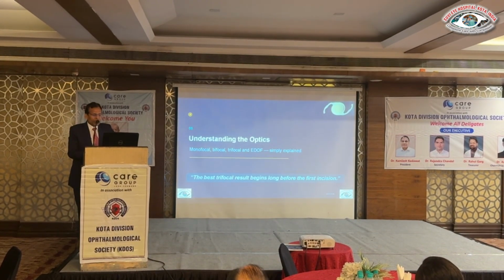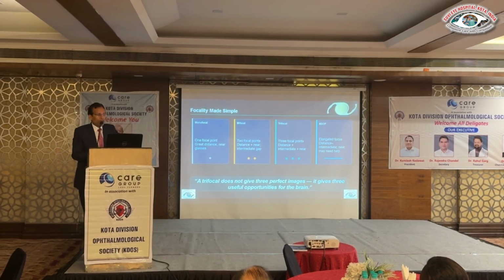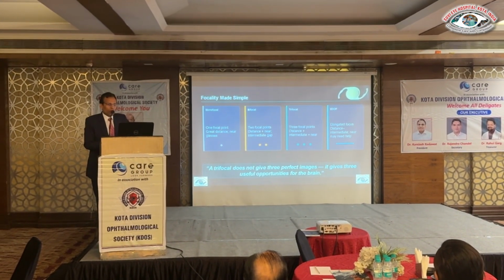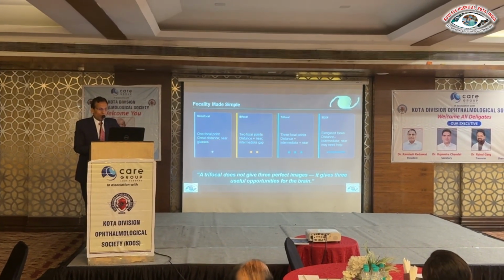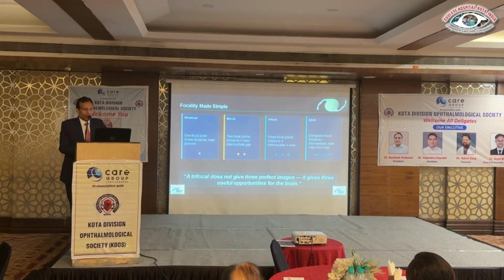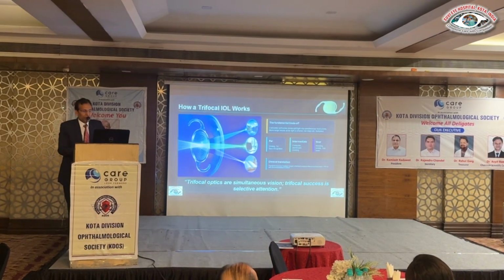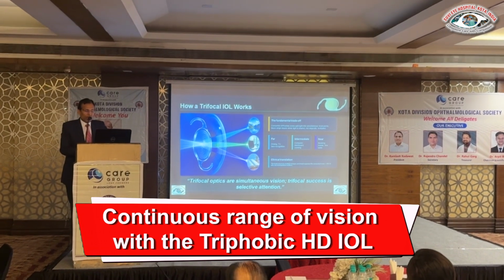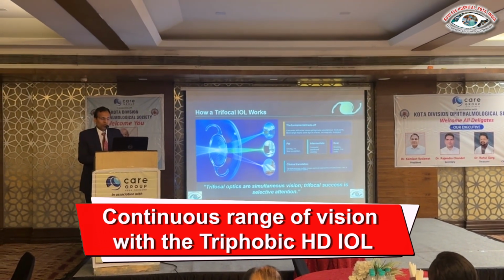So the best trifocal results begin long before even the first incision. If you talk about trifocal, multifocal, bifocal, monofocal or EDOF lenses, a premium lens does not give three perfect images. A trifocal lens gives three useful opportunities for the brain, and trifocal lenses can help us deliver good far, intermediate and near vision.